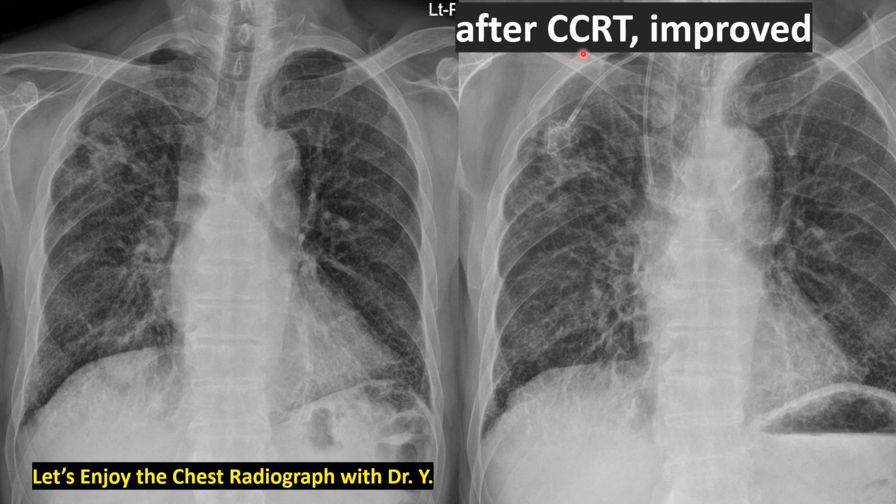concurrent chemoradiation therapy. After that, improved. The right lower lobe mass was very small or even disappeared. And main bronchus are looking normal and the mass shadow decreased or disappeared. Right paratracheal lesion also disappeared, but right upper lobe seems to be same as before.